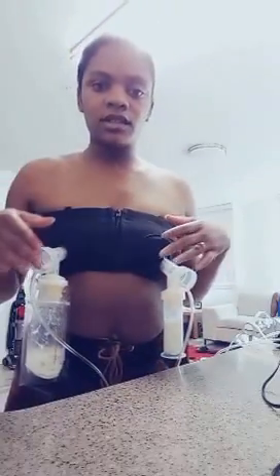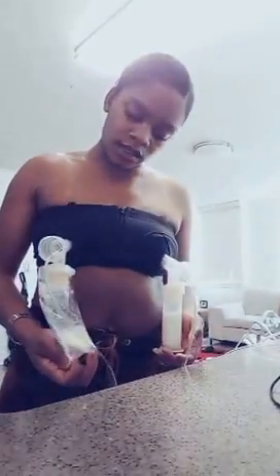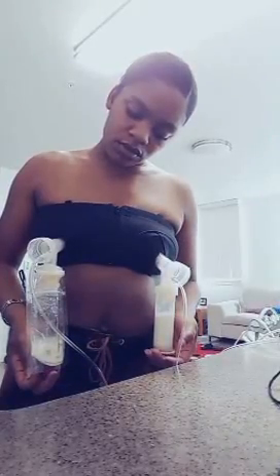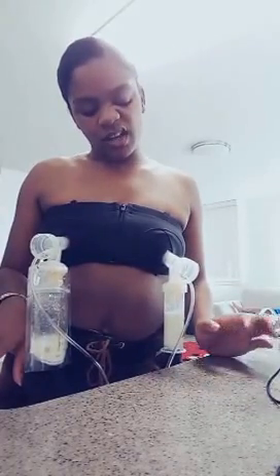So it's been about 10 minutes. This tube is 2.5 ounces and this bag is 5 ounces. I've managed to produce almost a full 2.5 ounce tube and about 2 ounces in the bag. So that's about 4 ounces of milk, which is not that bad. That's almost an entire small Medela bottle.